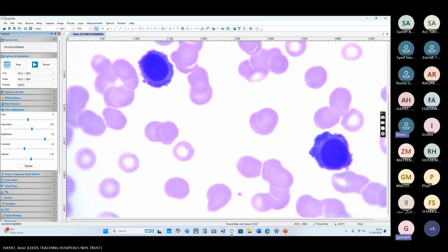And sir, if we are not provided with the flow cytometry, how will we report this blood film only on the morphology? Okay. So on the safe side, if you have no flow cytometry and no history, then you say this blood film contains leukocytosis with multiple rouleau formation and normal platelet count.